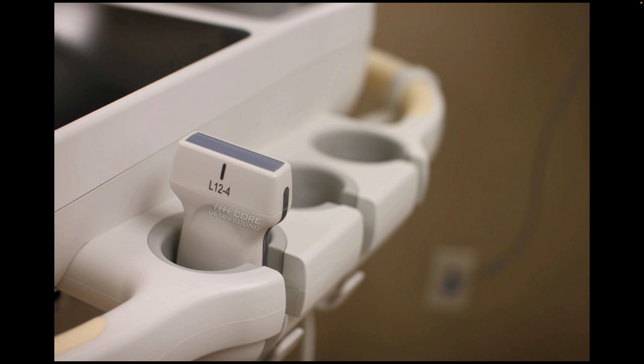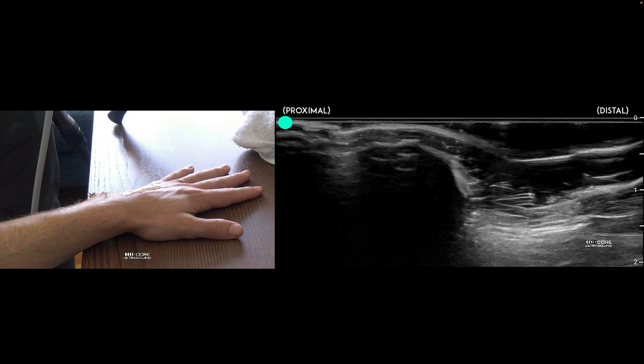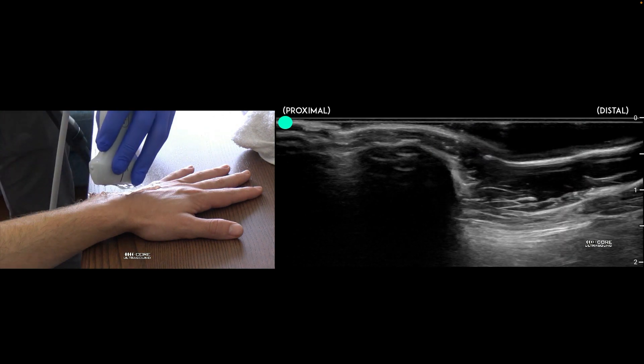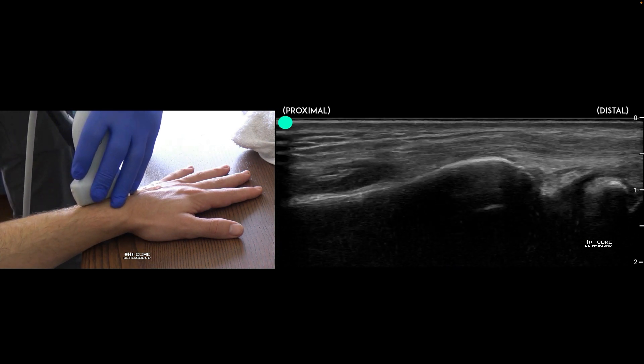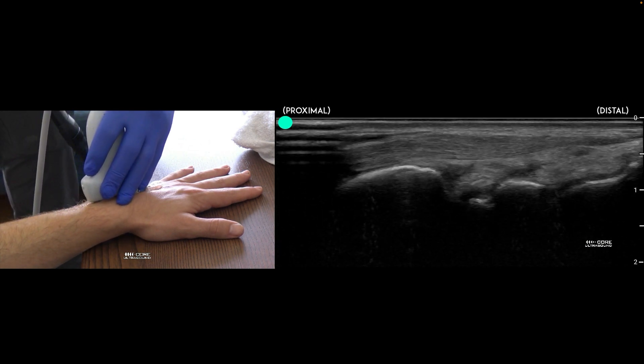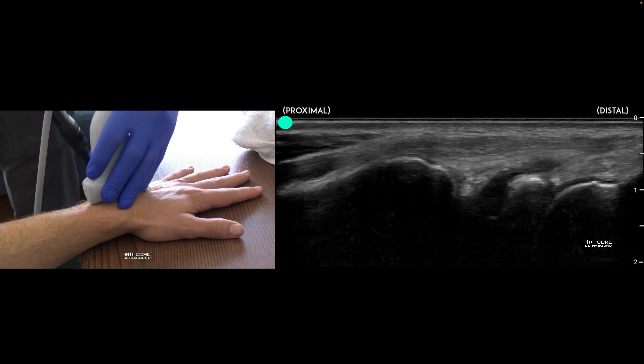Your probe of choice for this type of examination and procedure is going to be the linear transducer. With regards to identification of effusions, I like to approach this from a dorsal aspect, identifying the wrist joint in this manner.